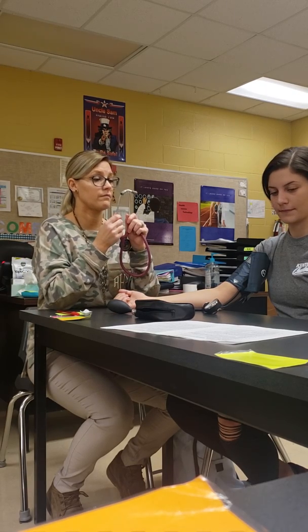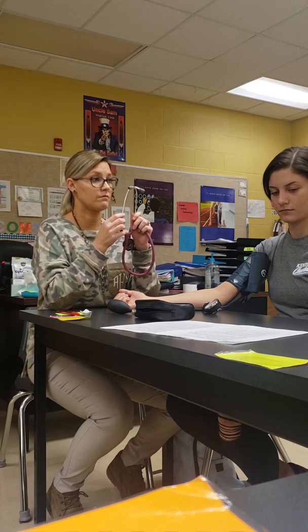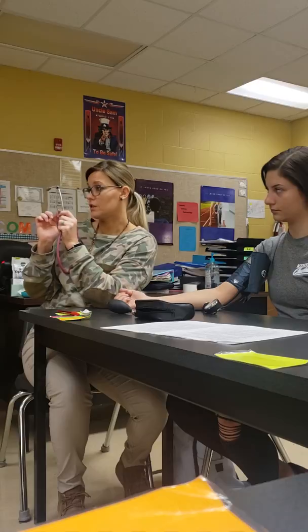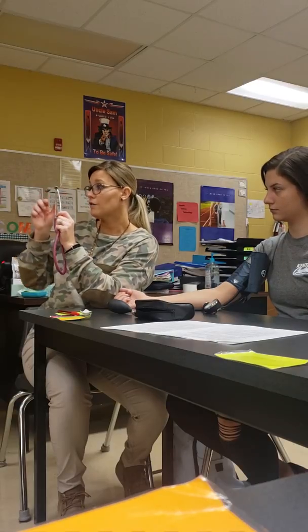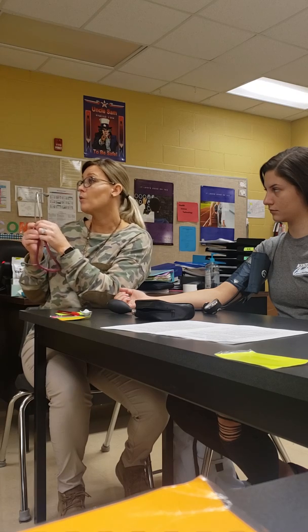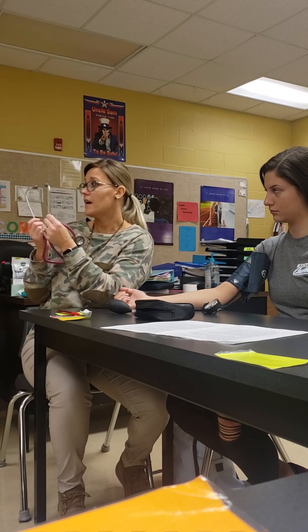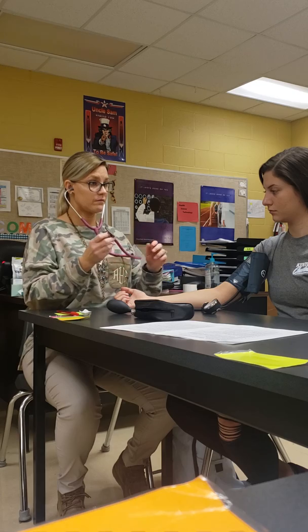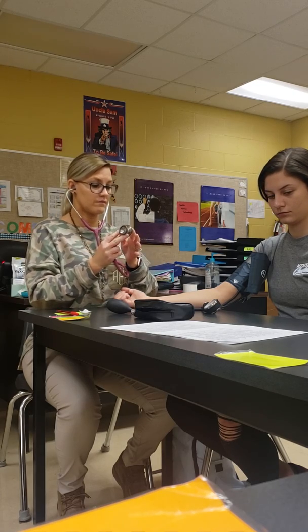Place the earpieces of the stethoscope in your ear. Stethoscope earpieces always point forwards. See how my stethoscope is curved and my earpieces are pointing forward. If I had it like this, then the earpieces are pointing towards me instead of away from me. I want them to point away from me. All right, and then you're going to place the diaphragm of the stethoscope over the brachial artery.